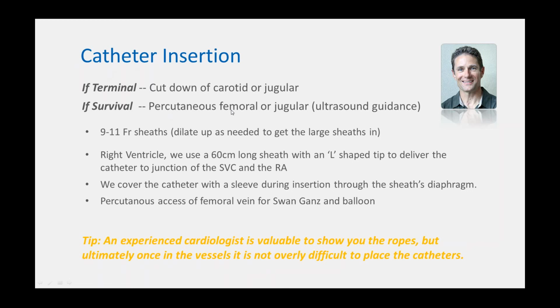If we need to get into the left ventricle, we always start at one of the femoral, and it doesn't really matter if you go right or left femoral. Otherwise, if we're going into the right ventricle, we'll start at the jugular, and we always start at the right jugular. Ultrasound can really be helpful finding vessels, particularly in pigs that can be hard to find. They're deep, they're not on the surface, you can't oftentimes feel them, and so if you can get a probe on it, you can see it, and you can get in pretty quickly.